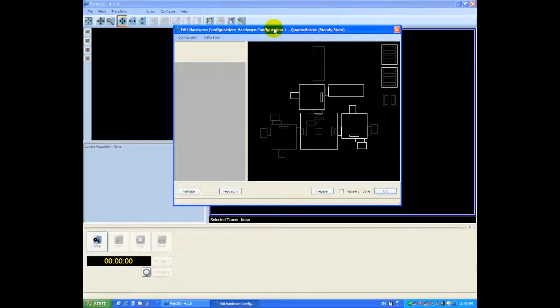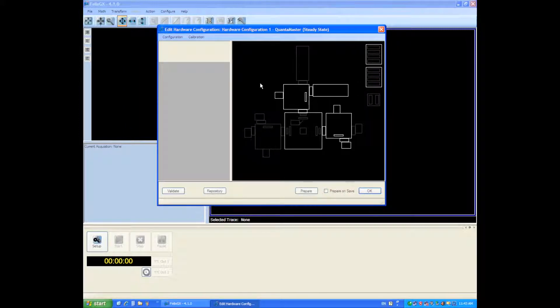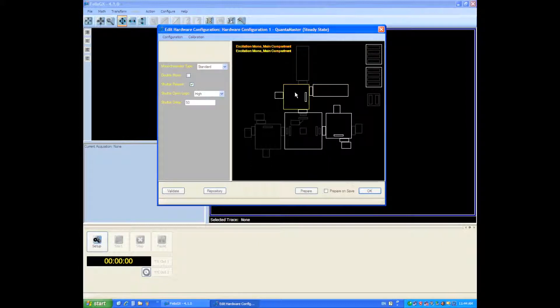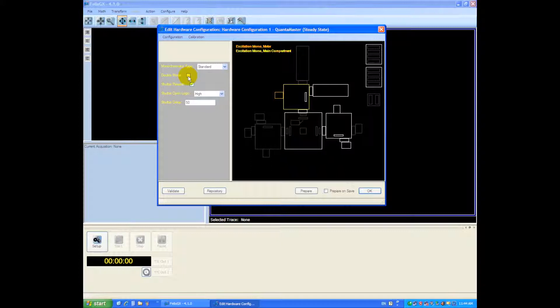Next thing we must do is find the light source. It's going to be a xenon arc lamp. You can see there's a few choices here. Next you'll want to configure your monochrometer. This monochrometer here is a double mono so I'm going to check on the checkbox. Standard monochrometers you would not check this on.